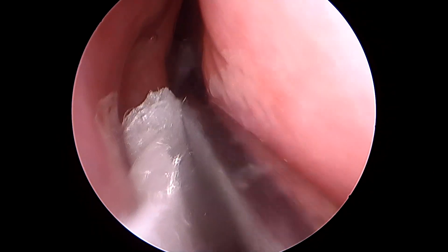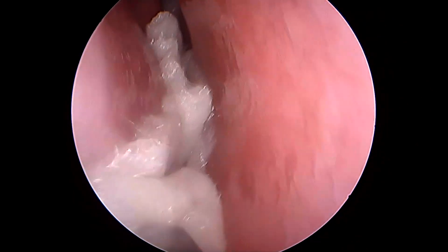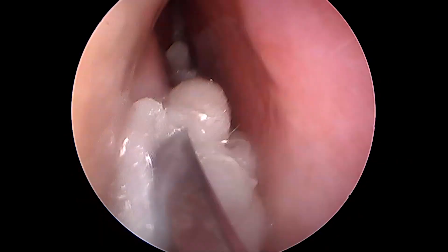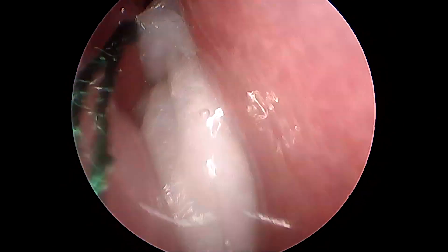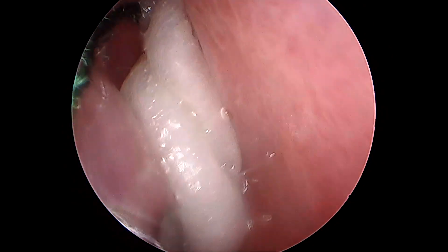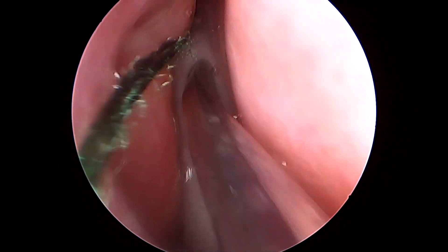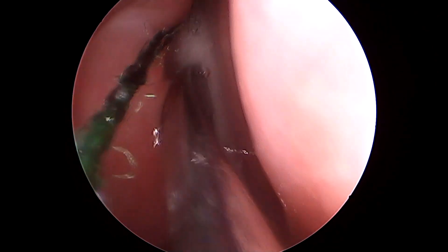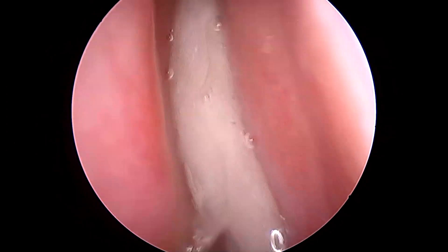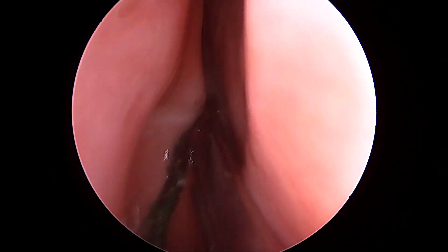I'm very gently going to place that with the help of a Freer's elevator, trying to negotiate this nasal patty between the turbinate and the septum. Note that the patient is not under any sedation or general anesthesia — the patient is conscious, awake, and oriented. Hence I'm using this nasal patty for decongestion and anesthesia.